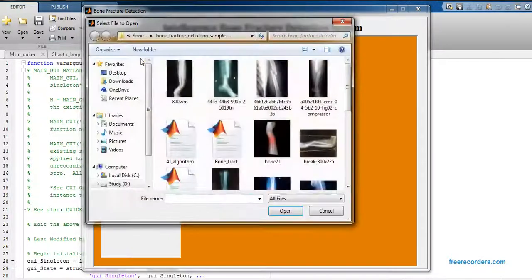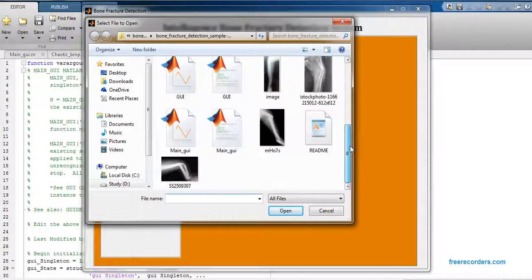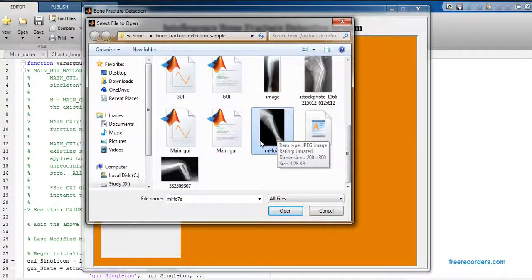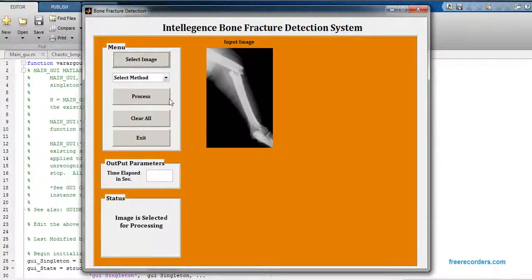Now just click this button to open current entry and select one bone image from input database. So I'm going to select this image from input database and just click on open. Now just select method, that is artificial intelligence. So basically I have mentioned only one method is there, that is artificial intelligence method. So just select that method.